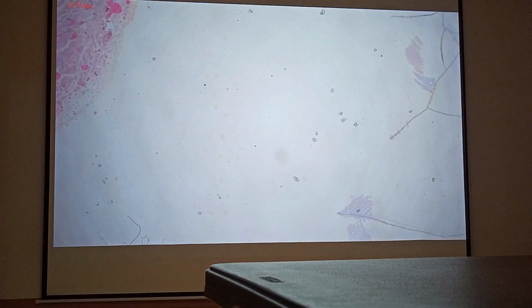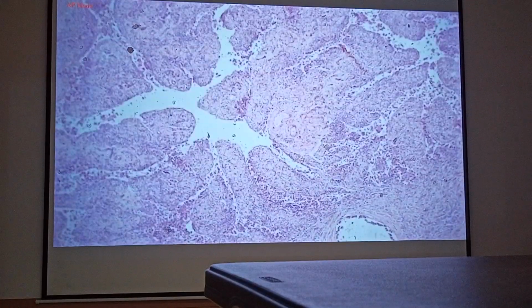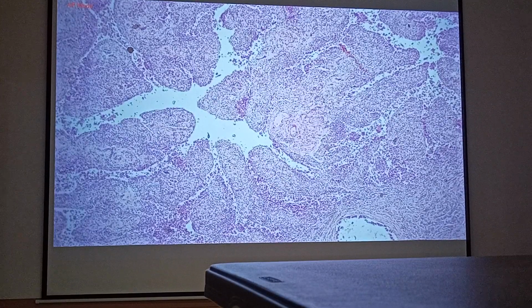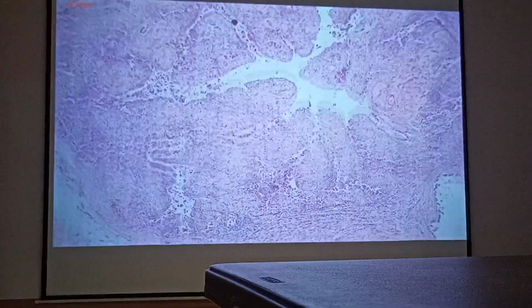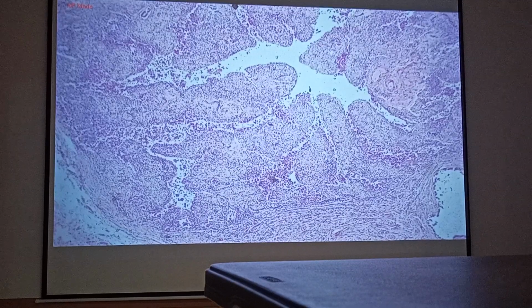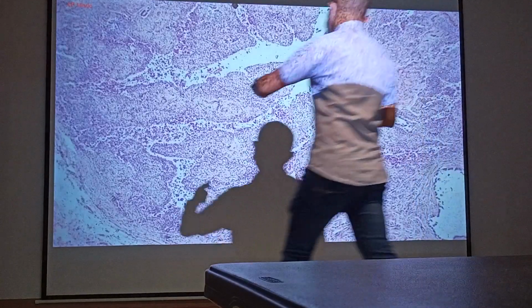This is diagnosed as acute salpingitis, or acute inflammation of the salpinx, which is more commonly called the fallopian tube. Now, remember the lumen of the fallopian tube is not round in shape. If you will remember your histology, the mucosa produces numerous finger-like projections into the lumen.